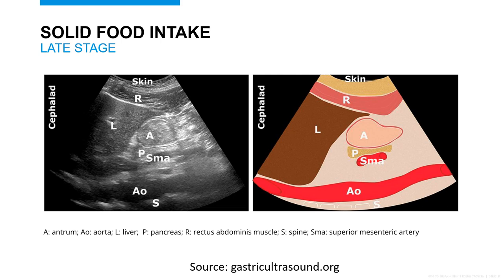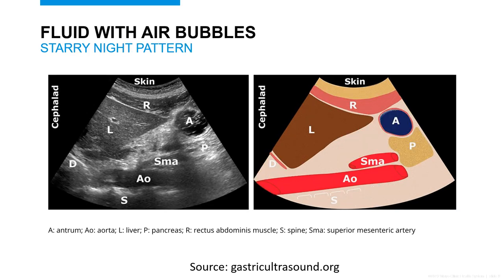Here we can verify we are at the antrum because we see the pancreas, SMA, and the aorta. Here we see an antrum with only clear liquid. We appreciate this with what we call the starry starry night pattern, named after Vincent van Gogh's painting. The antrum is distended with clear liquid, which appears dark or hypoechoic on ultrasound. The speckled white hyperechoic dots are air bubbles.